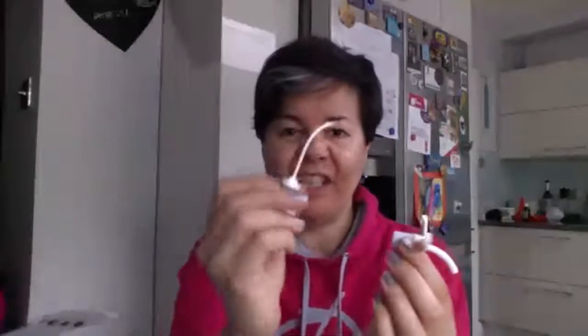So that's the tracheostomy. When you put them in, it comes with this thing called an introducer. Basically what that does is it makes this bit stiff so that when you put it into the neck, it's solid as opposed to being really bendy. You can imagine how much panic that would cause if it was all flopping about while you're trying to get it into the neck of your child who couldn't breathe while this was out.